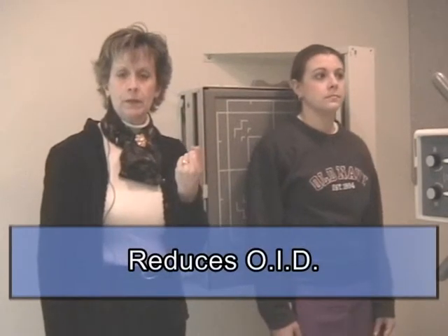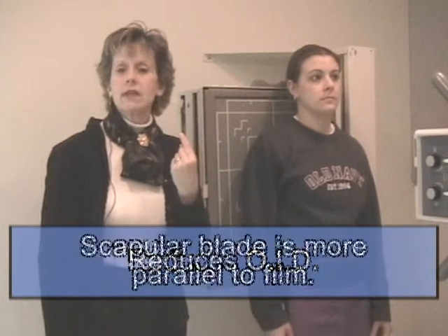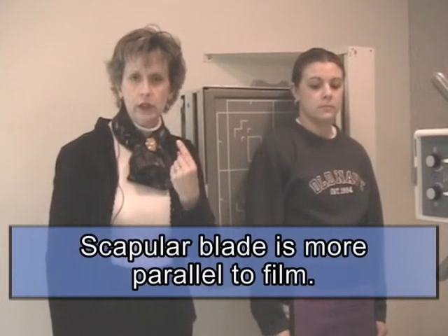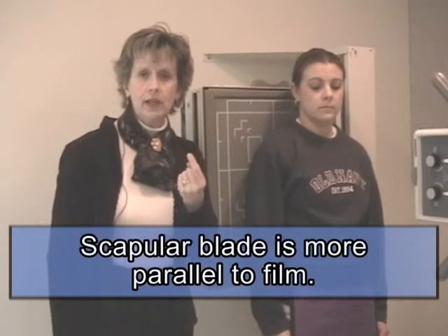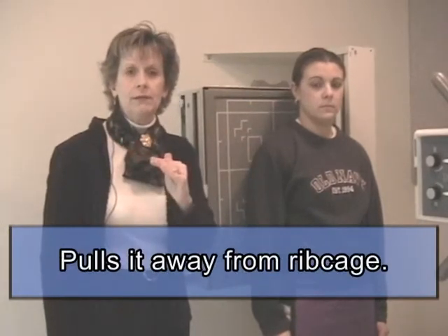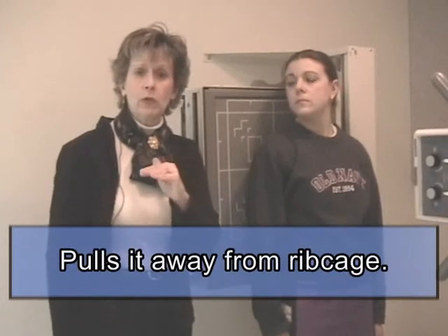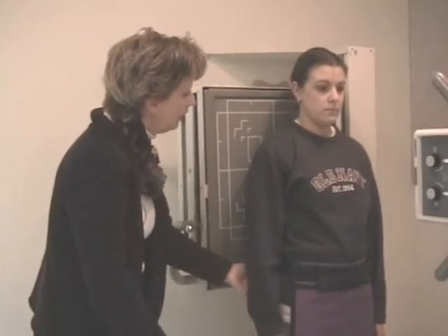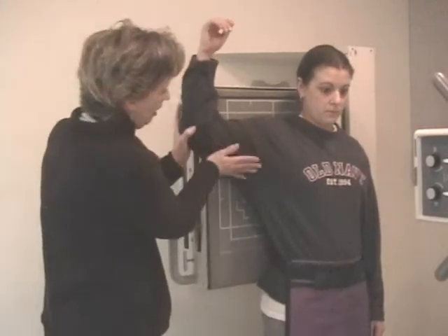The three things that pulling the arm out laterally to 90 degrees does: reduces OID, makes the scapular blade more parallel to the film so you are shooting more perpendicular, and it pulls the scapula away from the ribcage — not entirely, but significantly. That is uncomfortable for the patient to hold, so while I talk, I let the patient relax. We'll move fairly quickly and then let her rest her arm.